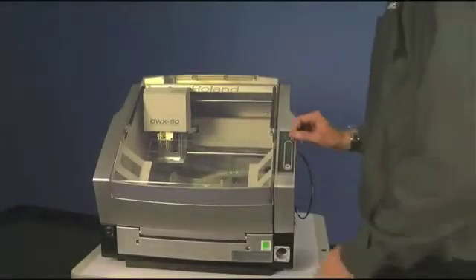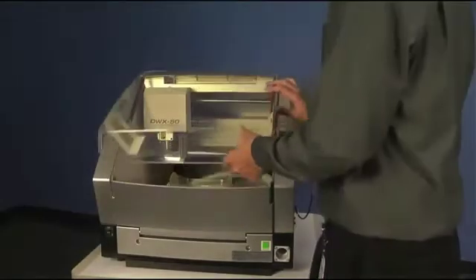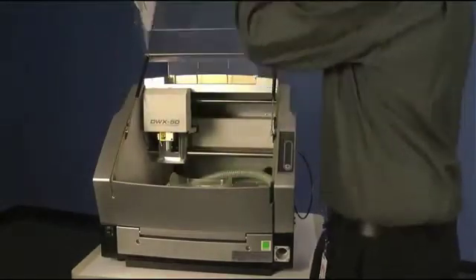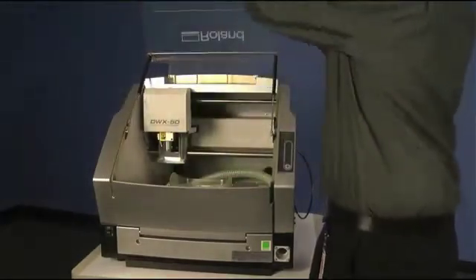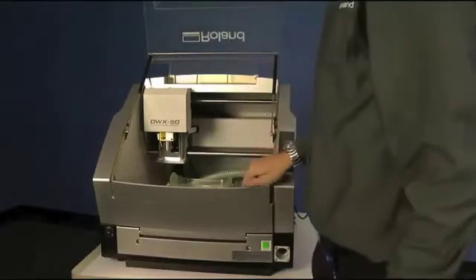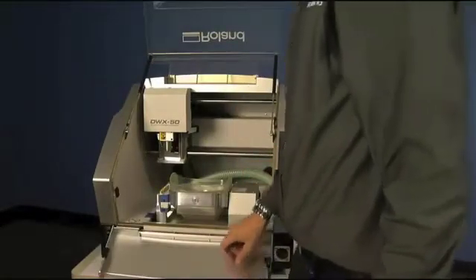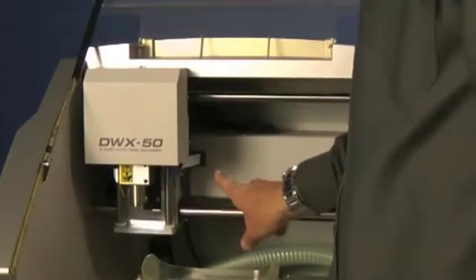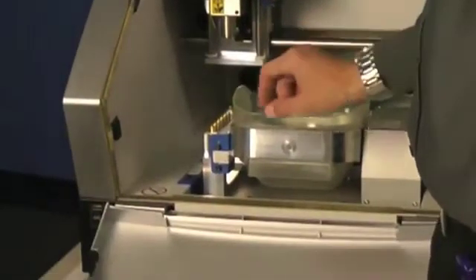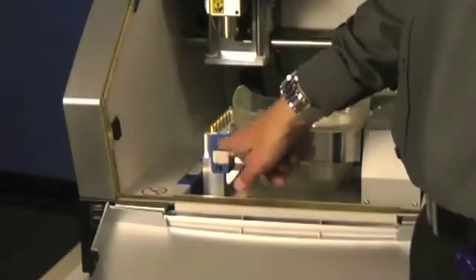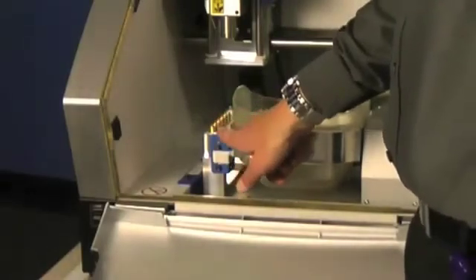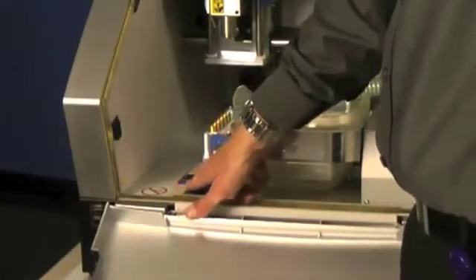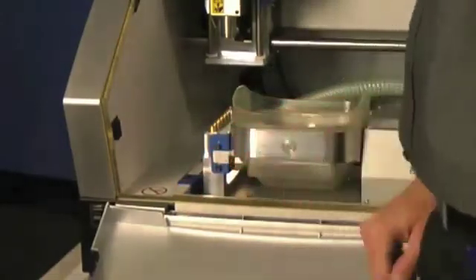Once you place the DWX 50 on a sturdy working surface, you can open the top front cover and the lower front cover. You're going to need to locate the three blue shipping brackets located on the top holding the spindle. The second one is going to be near the automatic tool changer holding the fixture and jig, and the bottom one will hold the entire fixture and jig as well from moving.